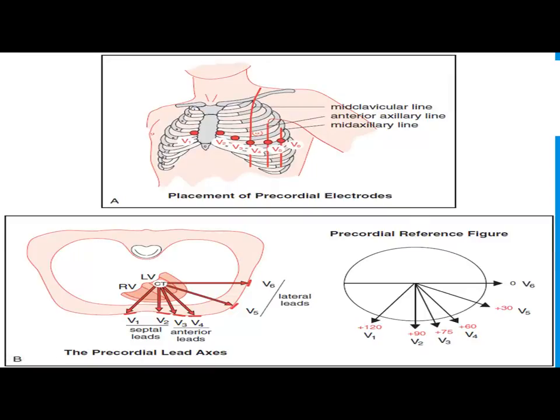So your placement of these is going to be very important. A lot of people have this wrong, and it actually gives you a poor 12 lead. You want it to where it's getting a direct look. That's the point of the 12 lead, to look at that left ventricle. So on any given day, you may have somebody that does the 12 lead, and if that's the sternum there, you'll see them do it there, there, there, then there.